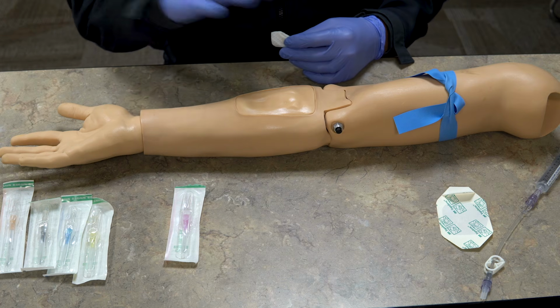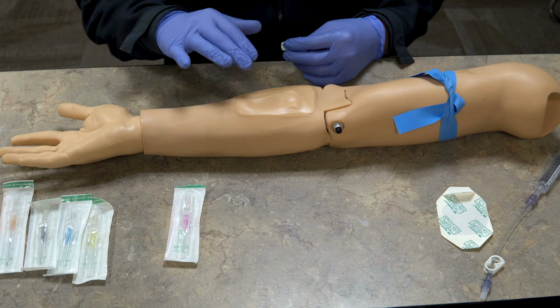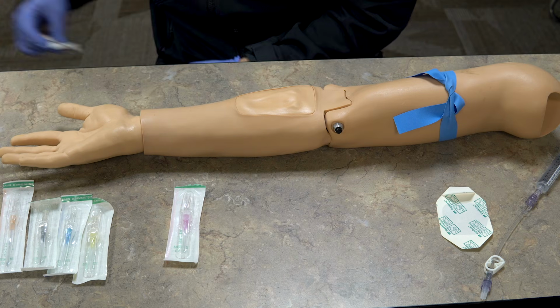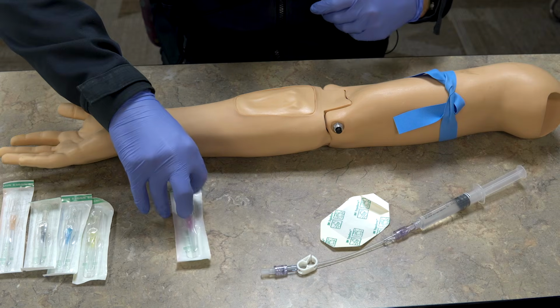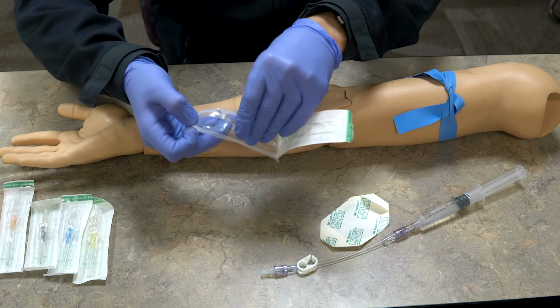Just make sure that you get that pretty saturated with alcohol or whatever you're using, and try to let that dry a little bit. Once I've sterilized it, you don't want to touch that if at all possible, because every time I touch that, I'm reintroducing germs onto the patient's arm, and it increases the risks of dermatitis or some other kind of infection. Okay, so I have everything I need right here. I've got the IV catheter. We can open the IV catheter just like that, and I know it's a 20 because it's pink.